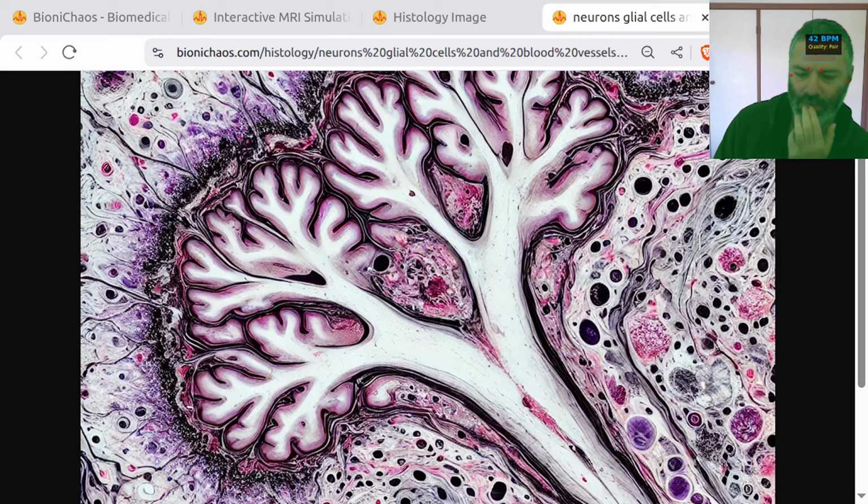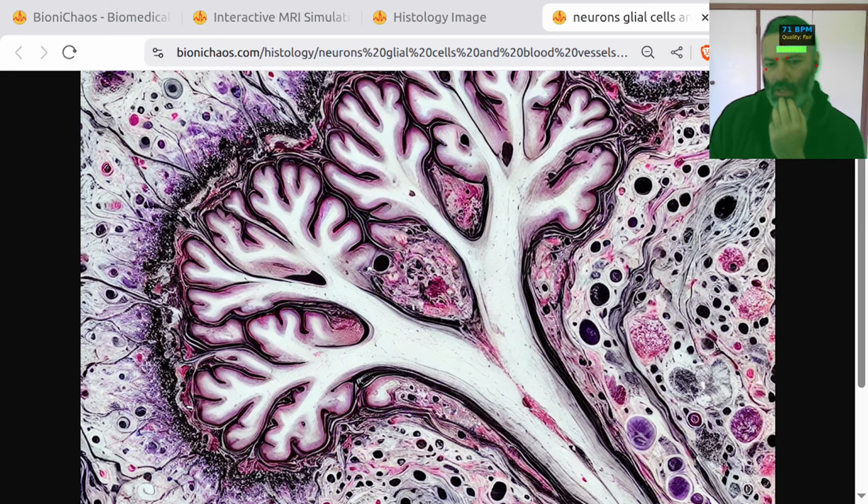Now, so if you had to develop a simple web application for it from scratch in the browser, how would you go about it? To build a simple web app for histopathology in the browser, you'd set up a front end with HTML, CSS, JavaScript, use a library like OpenSeadragon for image handling, process data with WebAssembly or TensorFlow.js, and handle backend processing with a lightweight server in Node.js or Python. You'll also integrate APIs for simulation and analysis.